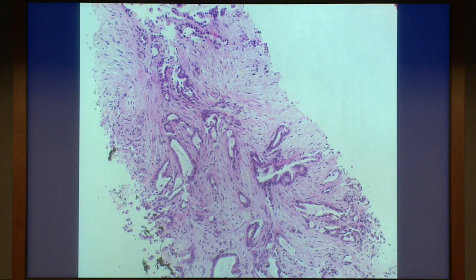We are really blessed with not only outstanding surgeons and oncologists, but with fantastic interventional radiologists and advanced endoscopists who give us in pathology really glorious samples that we can help the patient with. First of all, this is a pancreatic core biopsy, a 200x high power view.